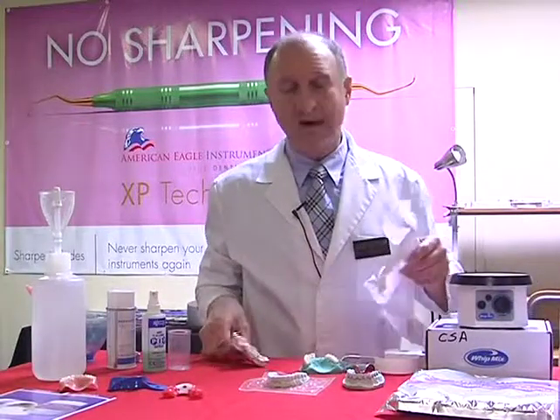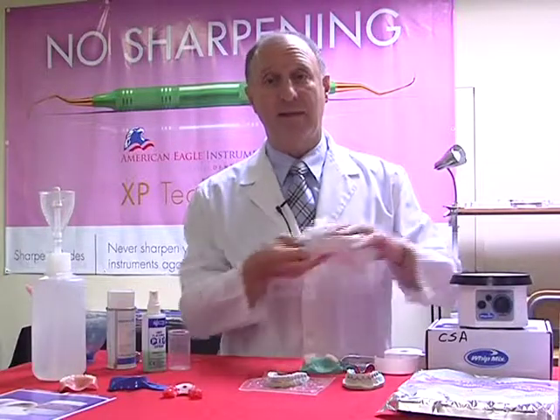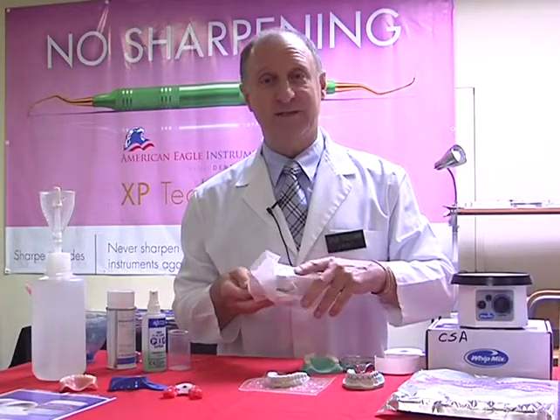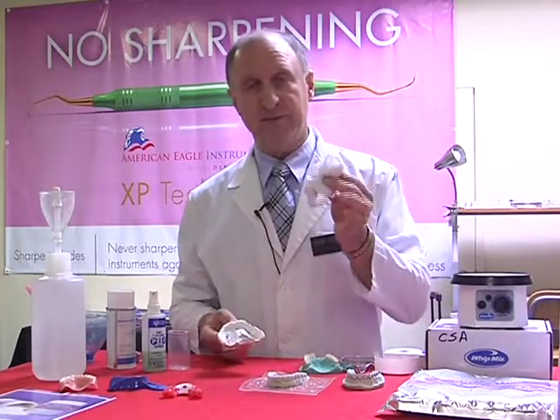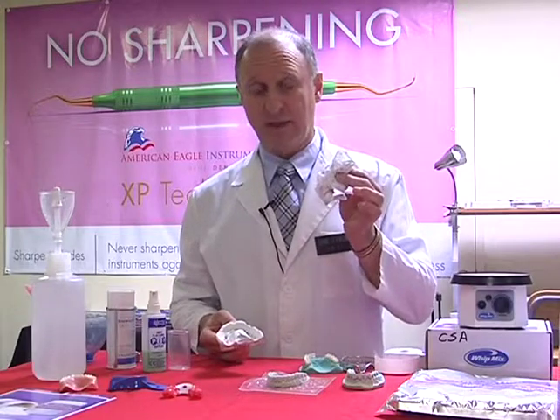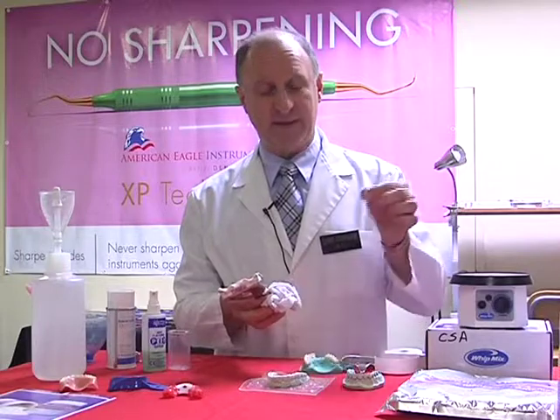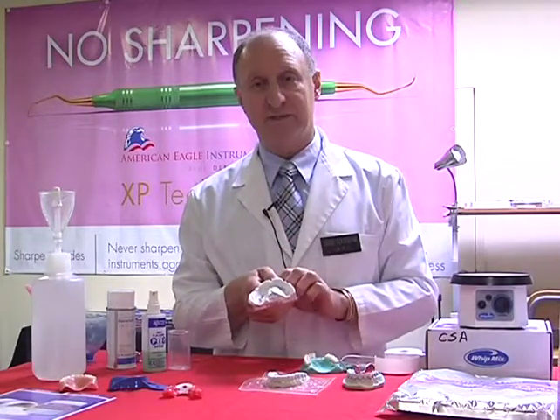They then normally wrap them around the impression and wet them and then bag them. 5 years ago, that was the case. We could do that safely, but not anymore. Things have changed because the paper we're using nowadays is recycled. When it gets wet, it's made to break down, and then fibers will actually depart from the surface and impart into the alginate impression surface.